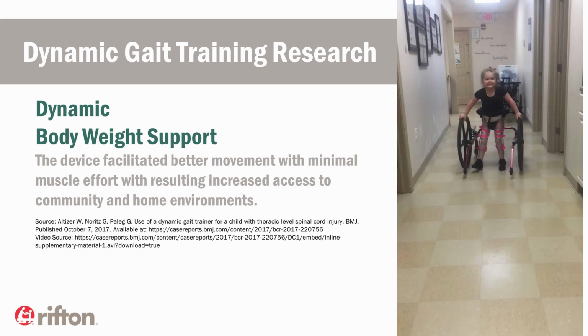Over 4 years, her walking progressed. She no longer needed trunk support, and she could walk with reciprocal stepping for up to 40 yards within 6 minutes. Another benefit with all this physical activity was that she did not develop contractures, and her bowel and bladder elimination improved as reported by her family.